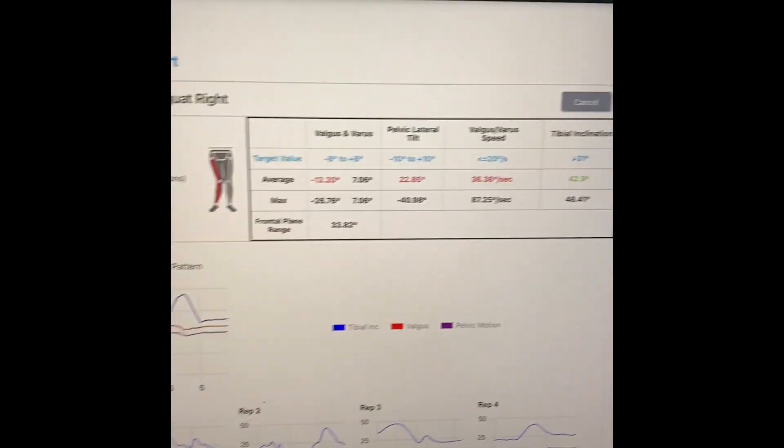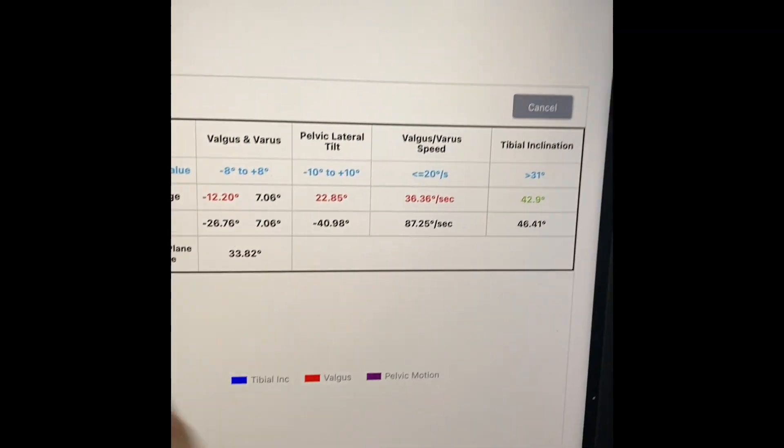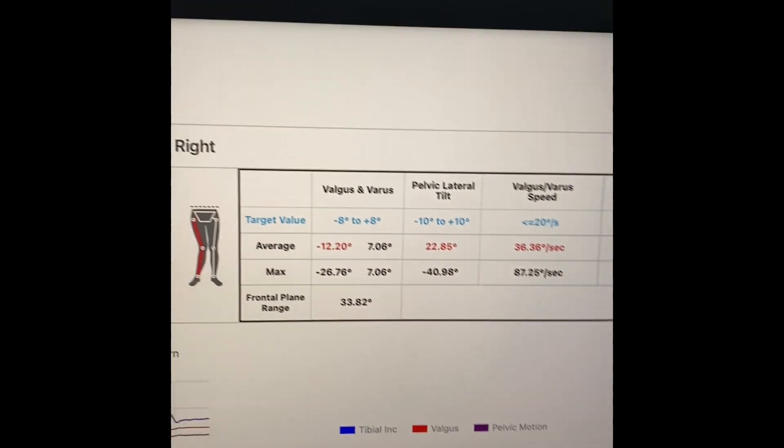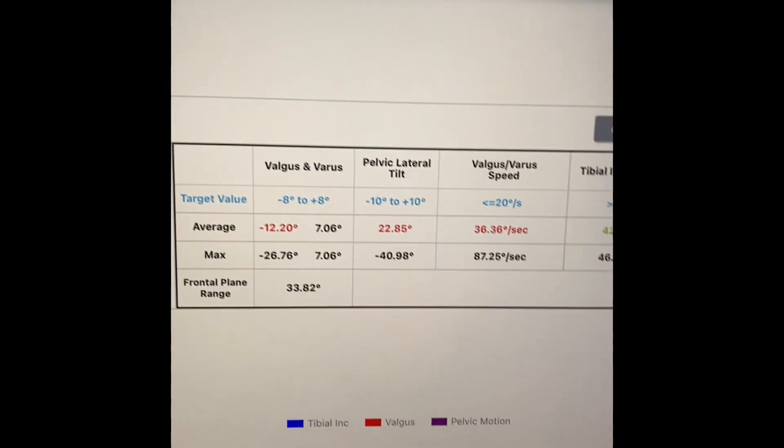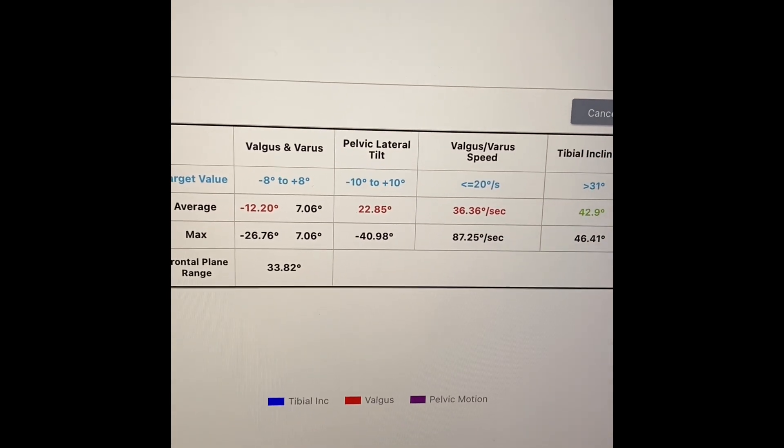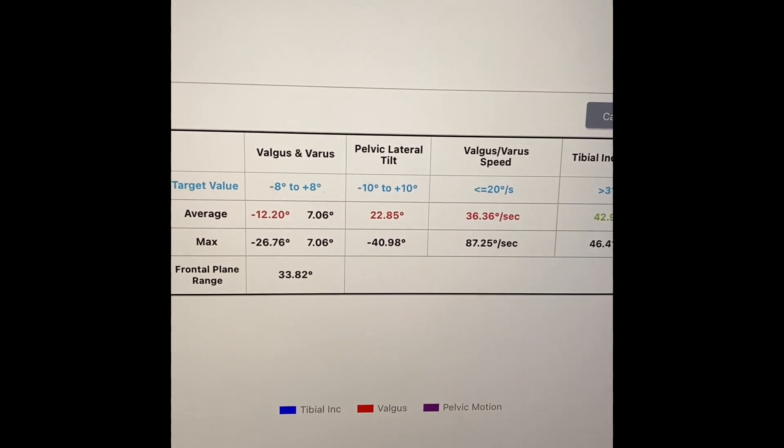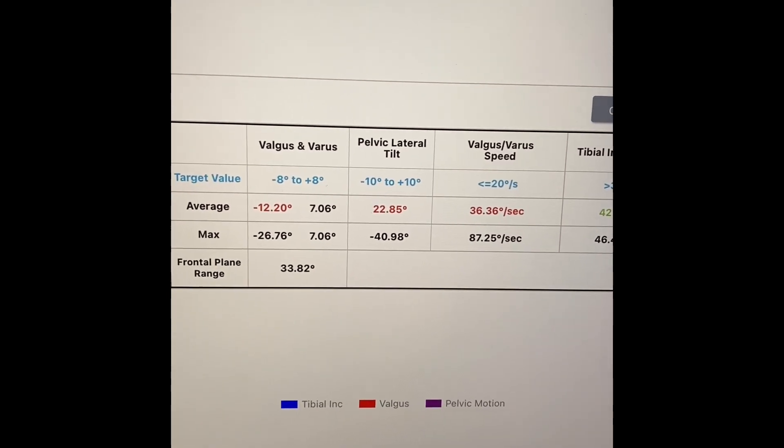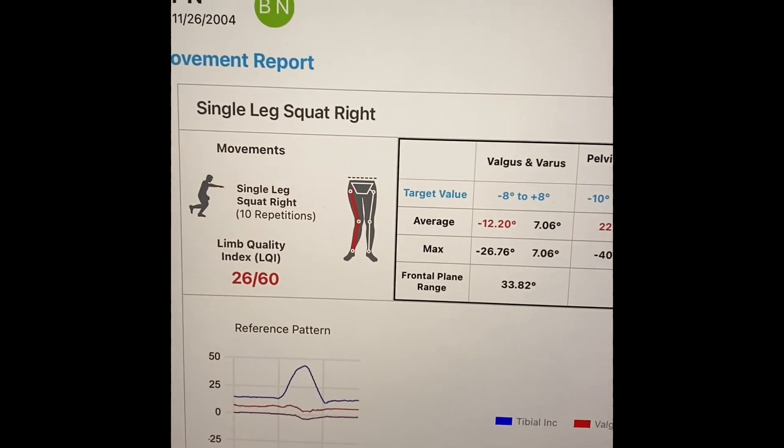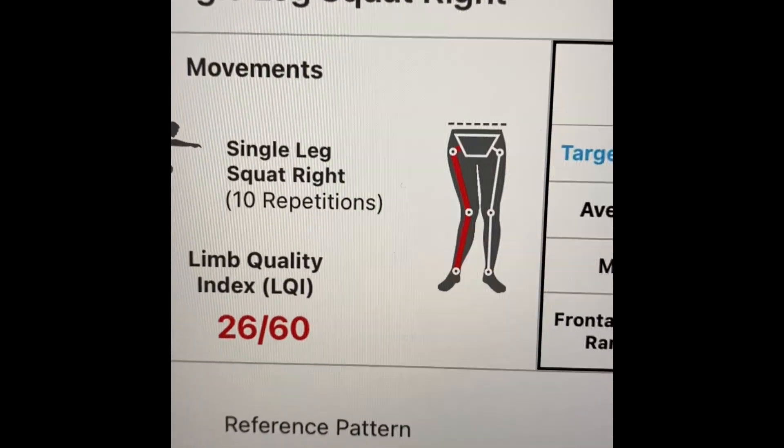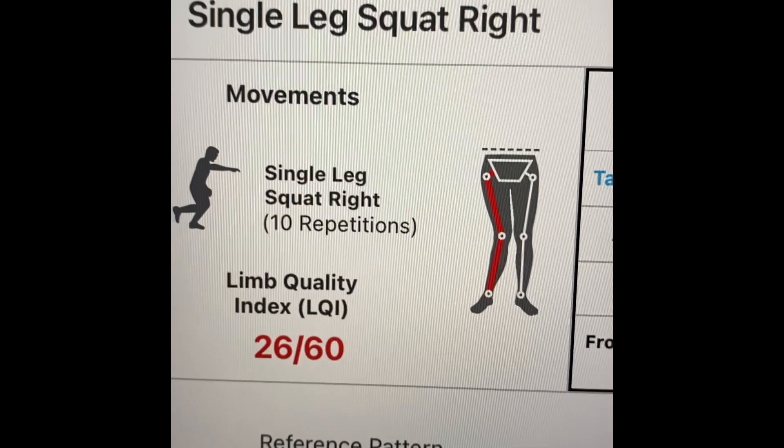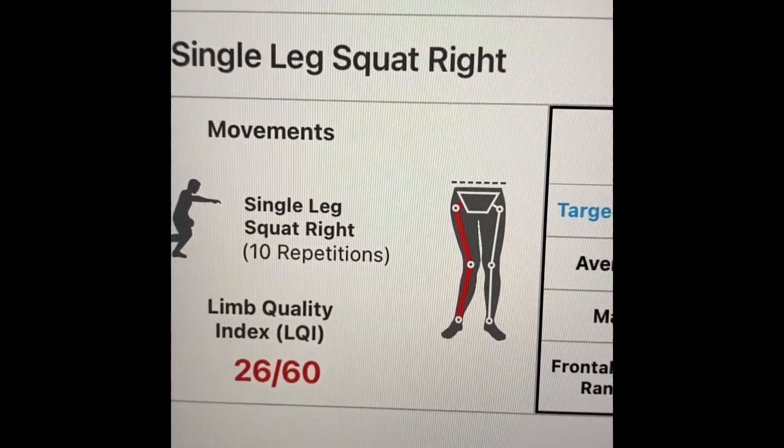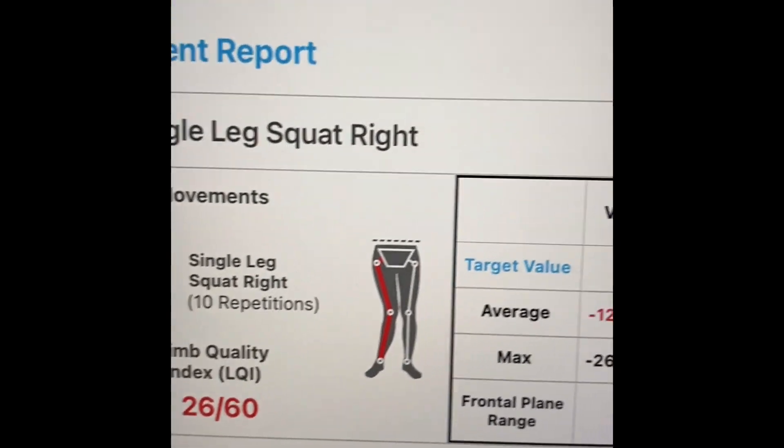We've pushed the detail button. And first thing you're going to notice is this box at the top. Numbers in the blue, those are based off of our normative values. And that is where you should be for each of the individual movements. You'll also notice that the limb is color coded. So you can quickly see at a glance what the limb looks like.